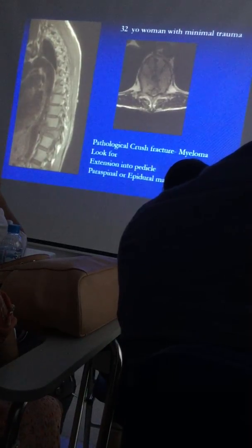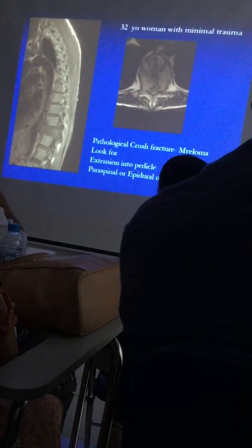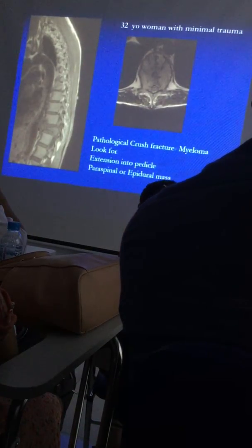Sometimes if you're not sure here, we CT that patient to look at the trabecular pattern. Sometimes you'll see the marrow infiltration better on the CT than you will on the MRI.